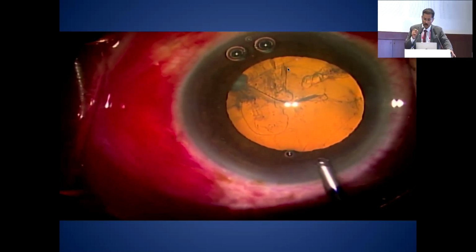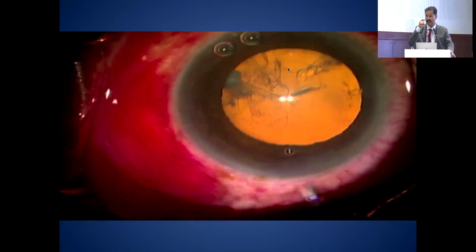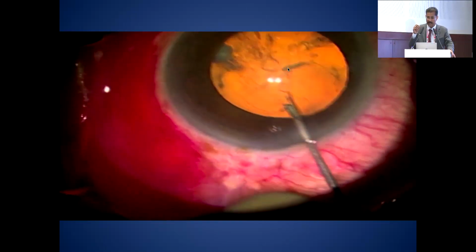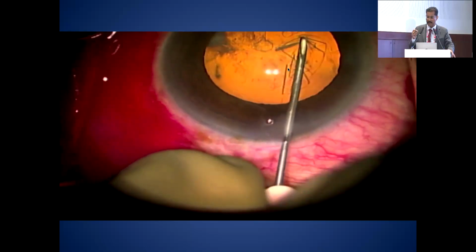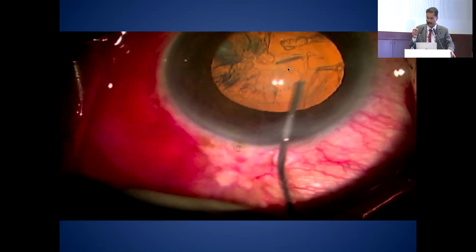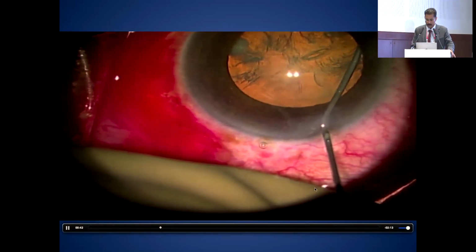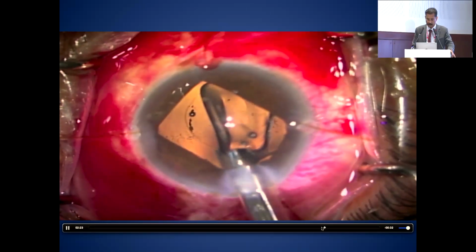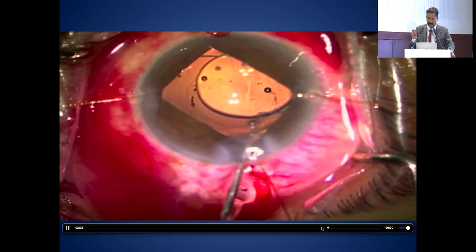And if it is too loose, you will see while puncturing itself, it is difficult. You will see folds radiating from the puncture. So that again shows the zonules are weak in the periphery. So use very sharp instruments and microrhexis forceps if you need to, and complete your rhexis. And without a rhexis, it is very, very difficult to place these kinds of stabilizing devices.